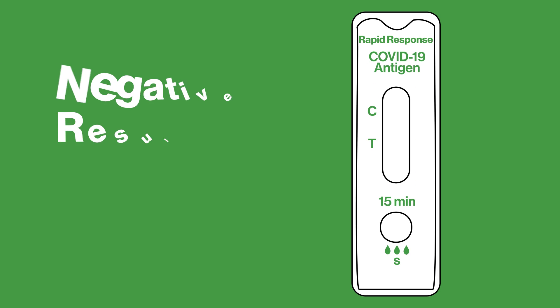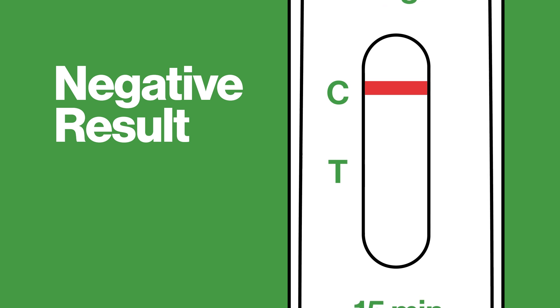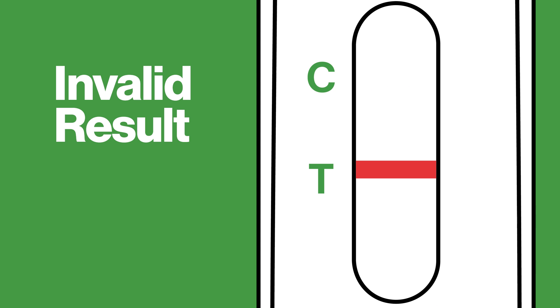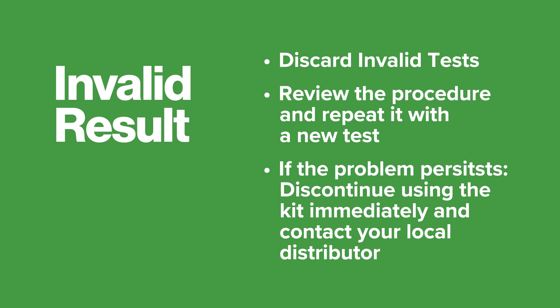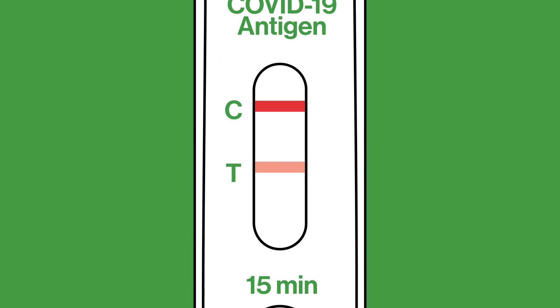The test result is negative if only one colored line appears in the control region, C, and there is no apparent colored line in the test region, T. The test result is invalid if the control line fails to appear. Results from any test which has not produced a control line at the specified read time must be discarded. Please review the procedure and repeat it with a new test. If the problem persists, discontinue using the kit immediately and contact your local distributor. This is a qualitative test only and the intensity of the test line cannot determine the viral load of your nasal sample.